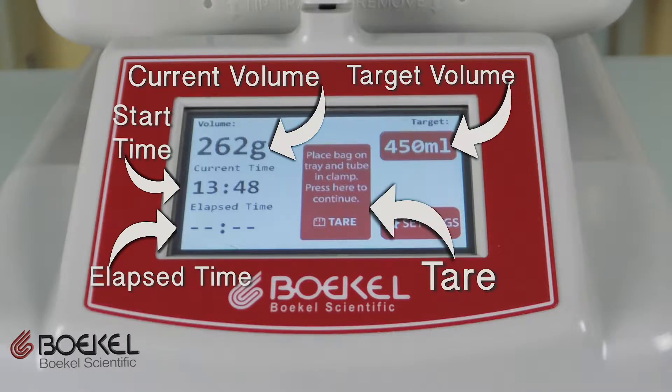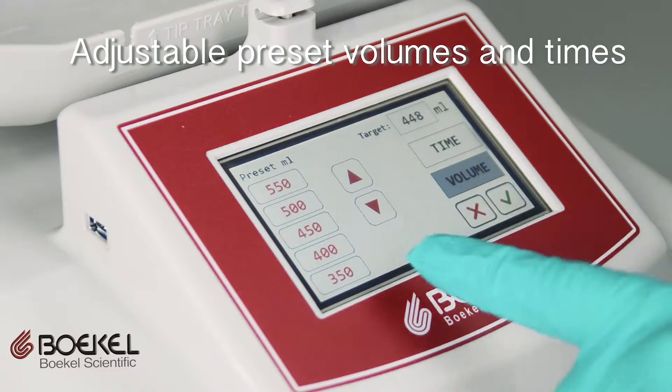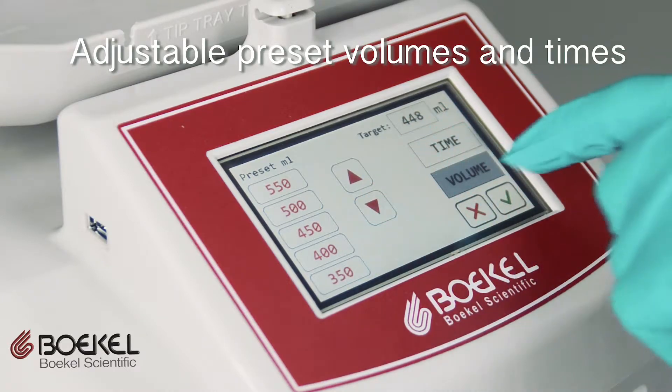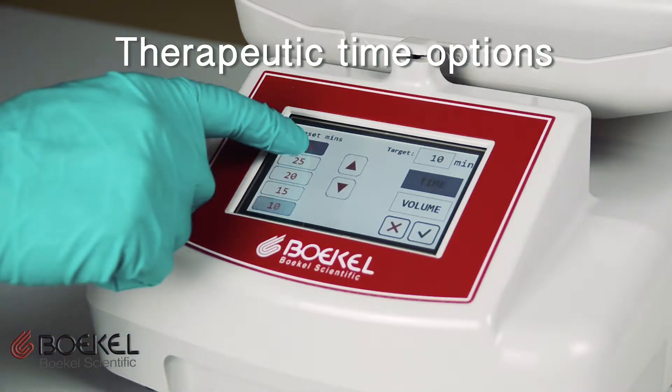The system can display in grams, milliliters, or alternating grams and milliliters. The system has pre-set target volumes for each run setup, and these volumes can be adjusted using the up and down arrows. For therapeutic use, the target can be set to time instead of volume or mass.